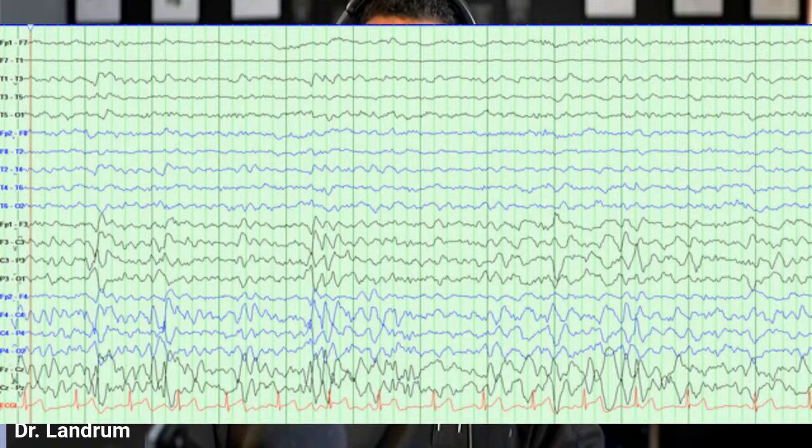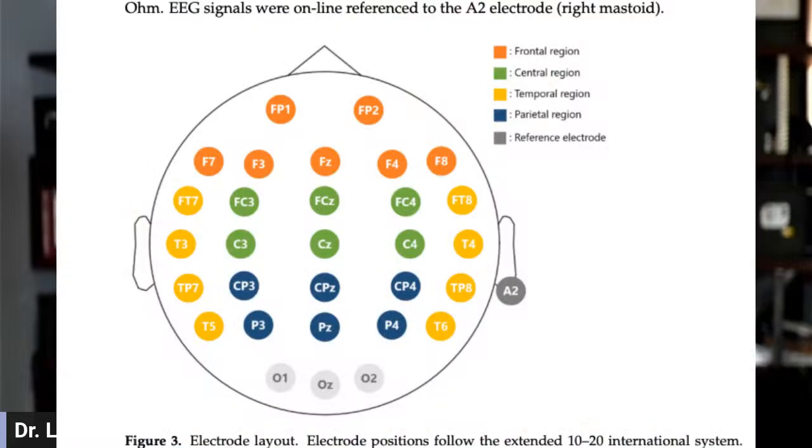So what does that look like if we were to actually record it? It looks like the following. You can see these electrical energies that are present, the waveforms that are present, and off to the side, you can see different demarcations like FP1, F7, O1, T2. And what is that? Well, if you recall, it's similar to what's present here.